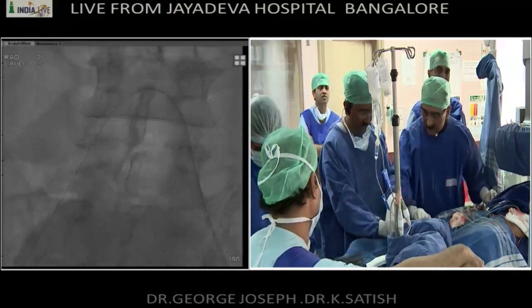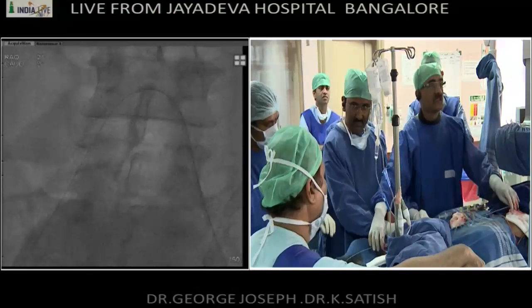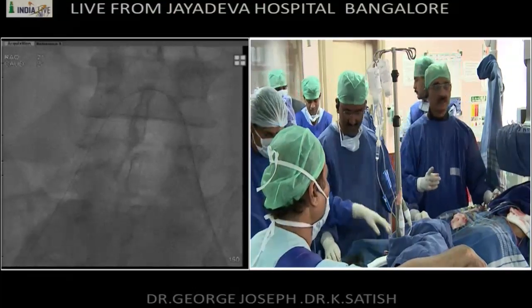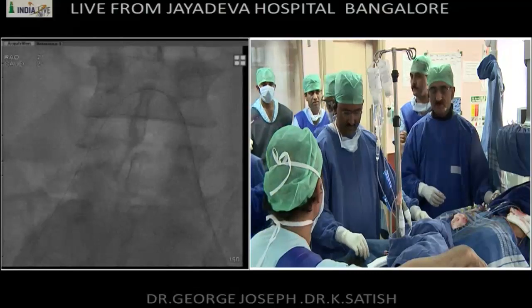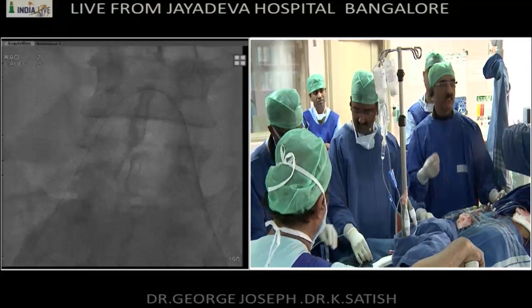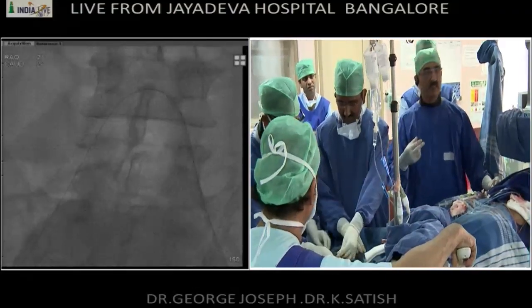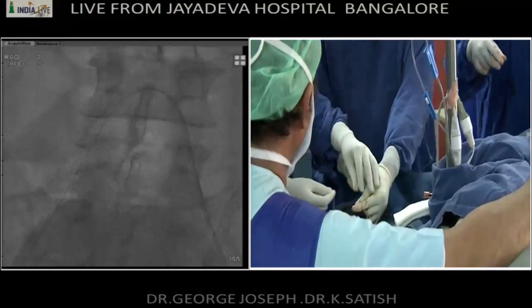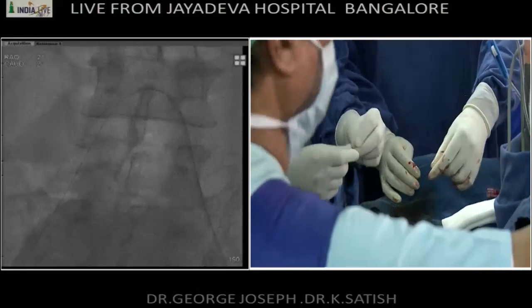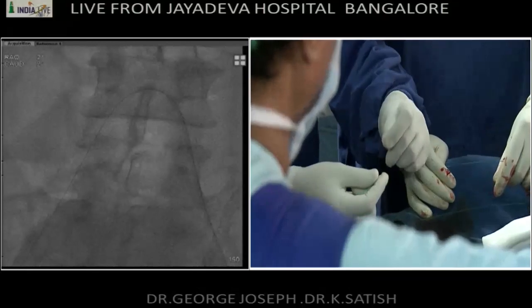This is the 6F JR? No, I want a 6F JR. See, the Cordis 6F JR has a very large lumen. So you can actually have an 018 wire and a 035 wire parallel inside it. So I will go with the 6F JR retrograde till I reach the bifurcation, and then I will pass a parallel thermo wire up the aorta.